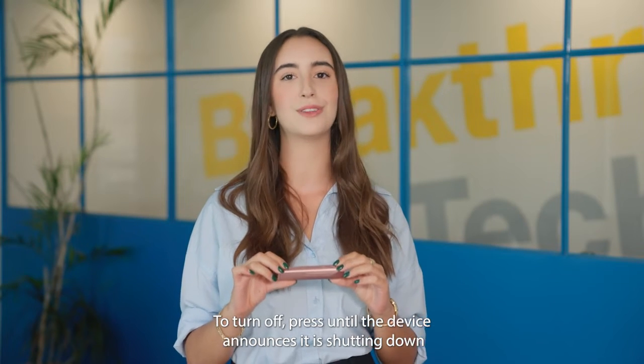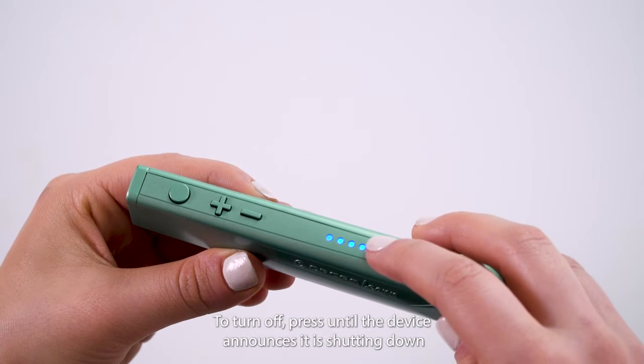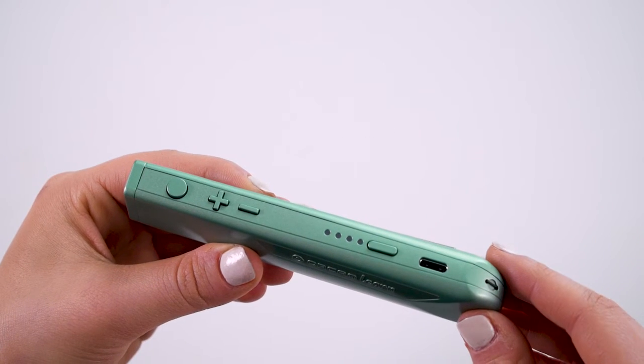To turn off, press until the device announces it is shutting down: Shutting down. Bye-bye.